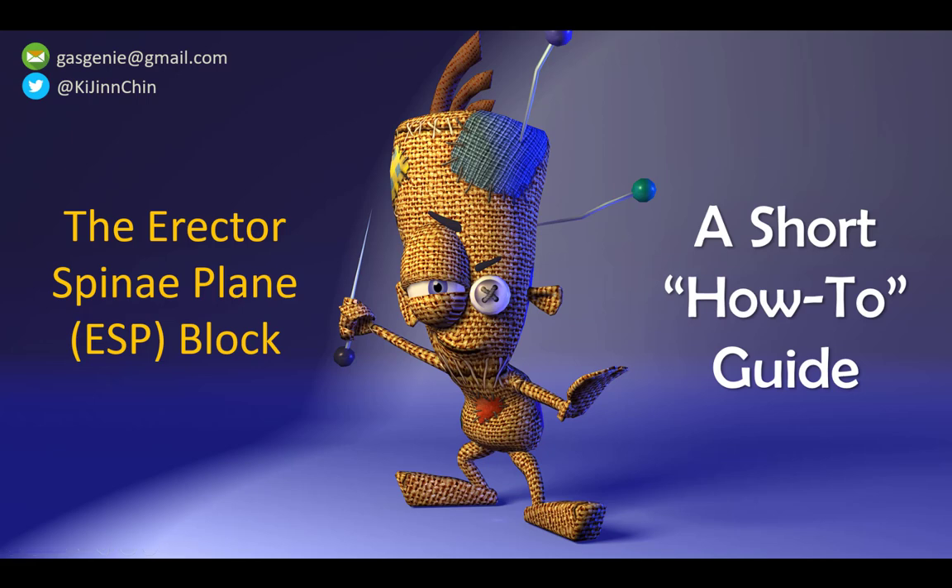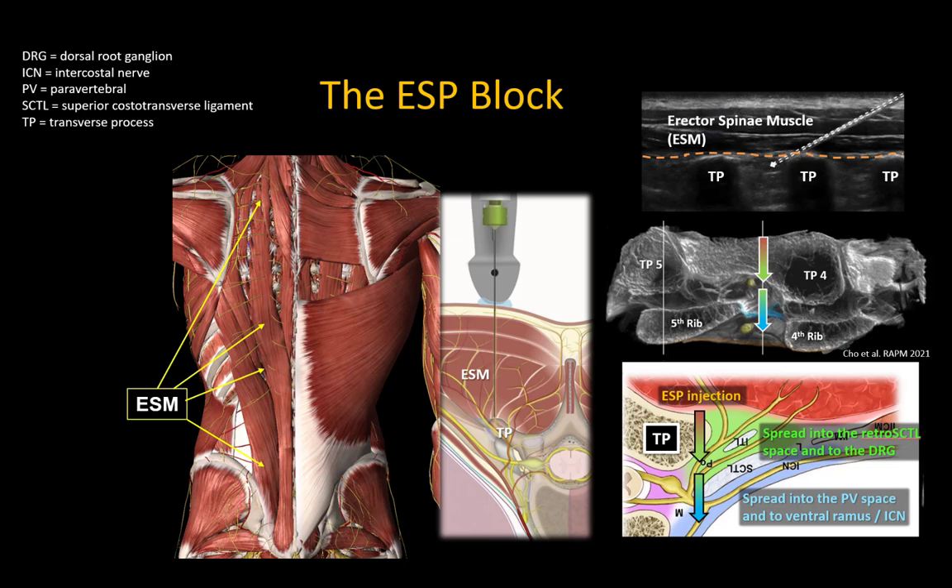This short video covers the basic principles of how to perform the erector spinae plane or ESP block. The ESP block can broadly be defined as an injection into the fascial plane deep to the erector spinae muscle that runs the length of the posterior torso, usually in the same parasagittal plane as the tips of the vertebral transverse processes.